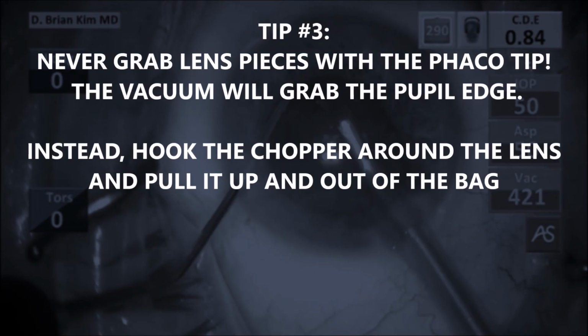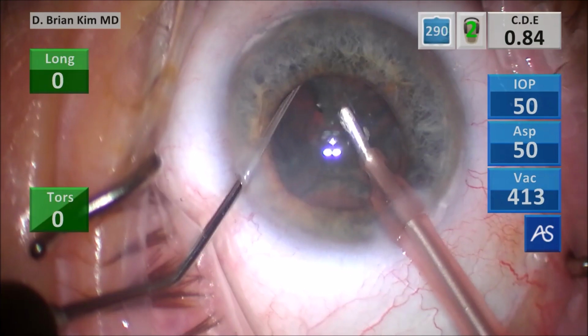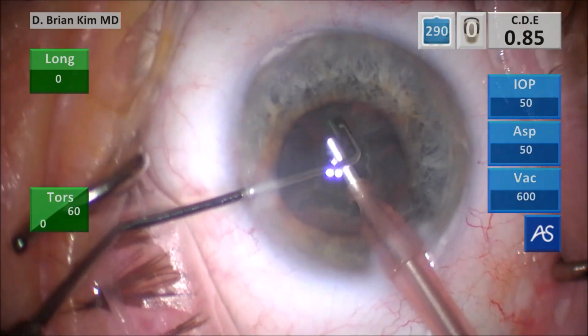Never grab the lens pieces with the phaco tip. If you grab it with the vacuum, you might grab the pupil edge. So instead, hook the chopper around the lens piece and pull the lens piece up out of the bag. That is really the simplest and easiest way to get after lens pieces. So go ahead and pull that piece up out of the bag with the chopper.